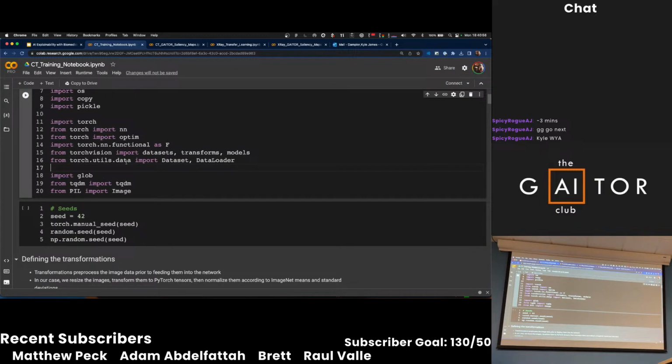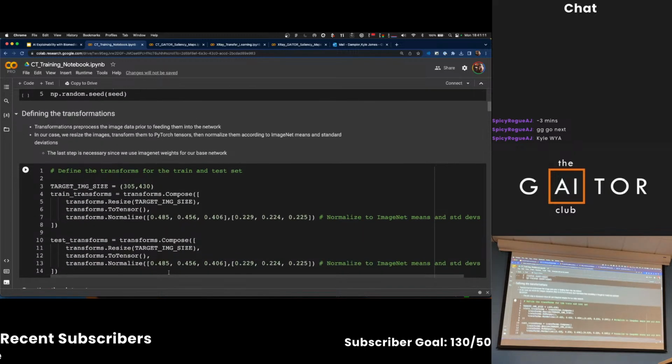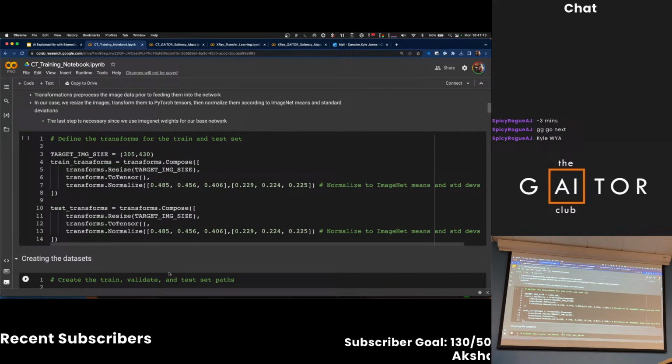So there's a pretty predefined pipeline you kind of have to go through, and most of it is data. So I'll walk you through it quickly. First, you define the transformations you want to do on the data. This is image pre-processing before the network, and PyTorch has a thing where you can just input a list of the transforms.